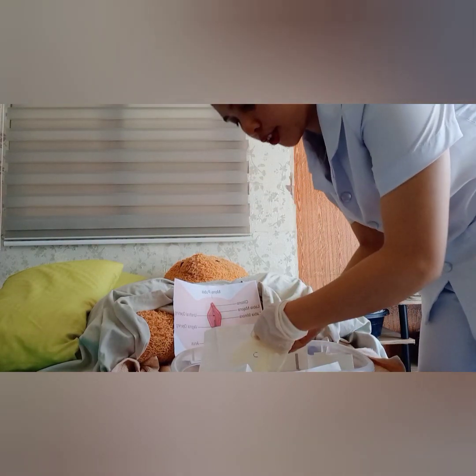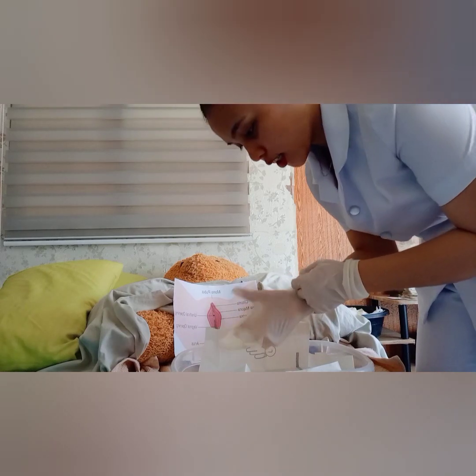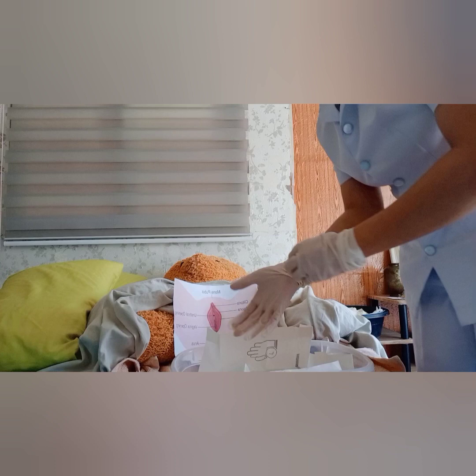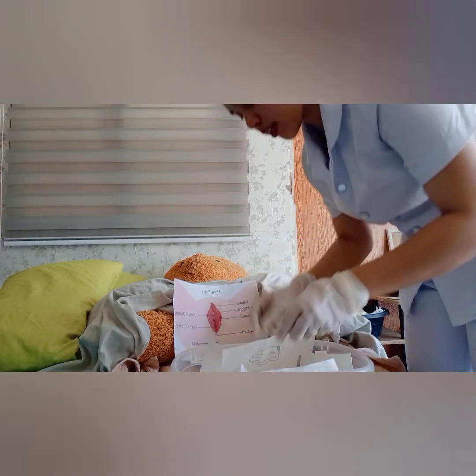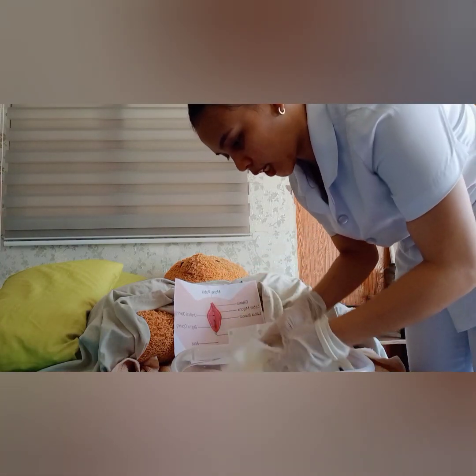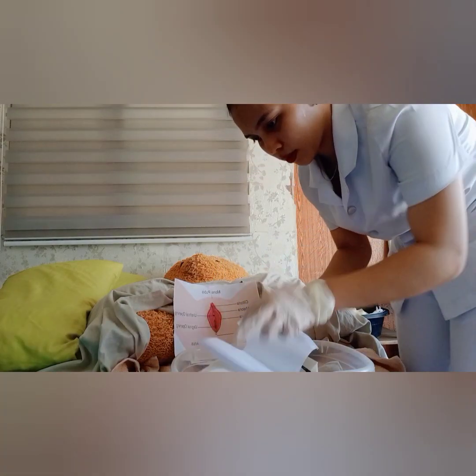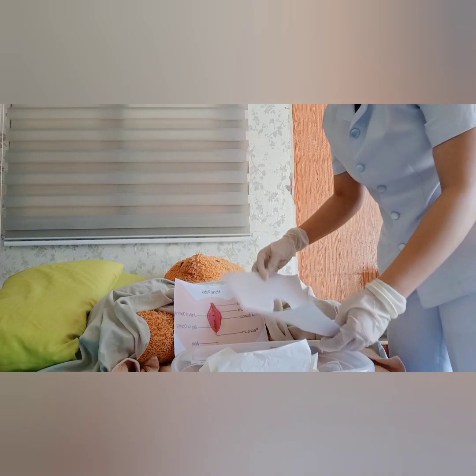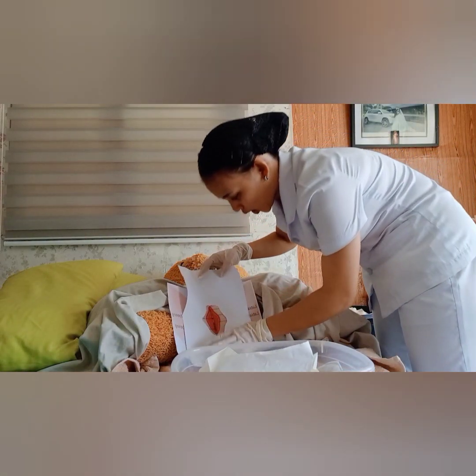So the rationale for this is to keep you safe from any discharge coming from the patient. The next thing that we're gonna do is put on the eye sheet. So the rationale is to drape the other part of the urinary meatus. Okay, this is the right.